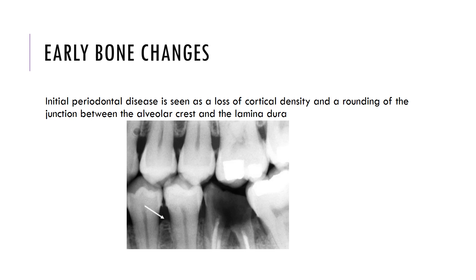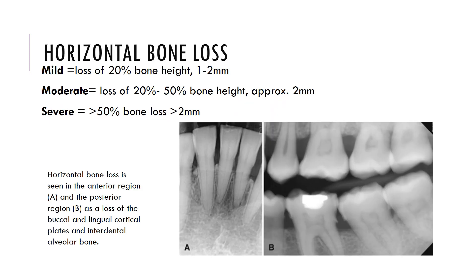Early bone changes in initial periodontal disease are seen as loss of cortical density and rounding of the junction between the alveolar crest and the lamina dura, as shown in the image with the white arrow indicating a rounded cortical edge. This is in contrast to the normal crestal bone which shows a sharp angle with the lamina dura. Horizontal bone loss is bone loss seen in the anterior and posterior regions with loss of buccal, lingual cortical plates and the interdental alveolar bone.